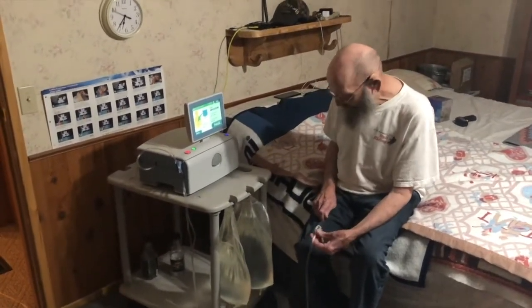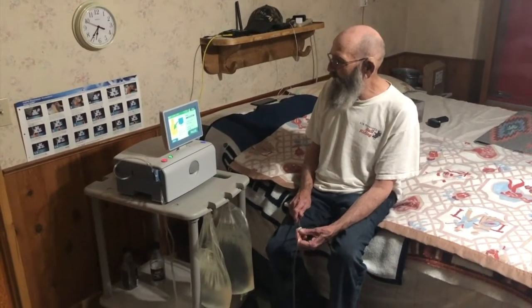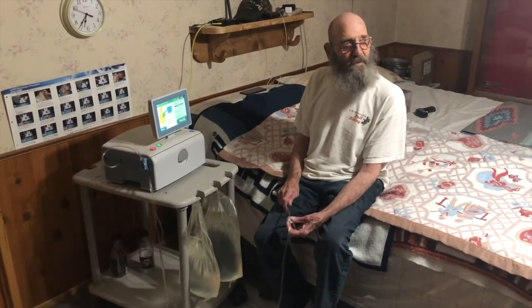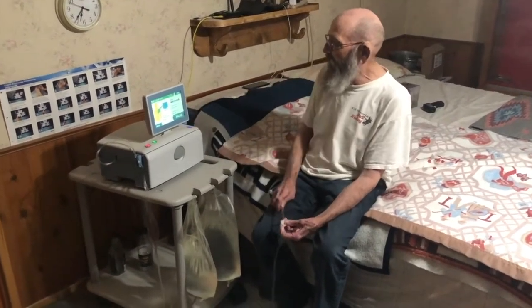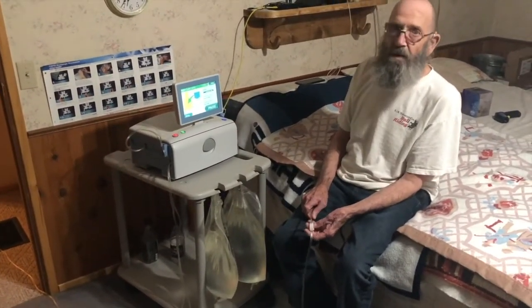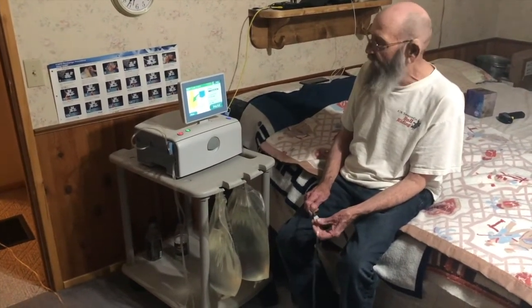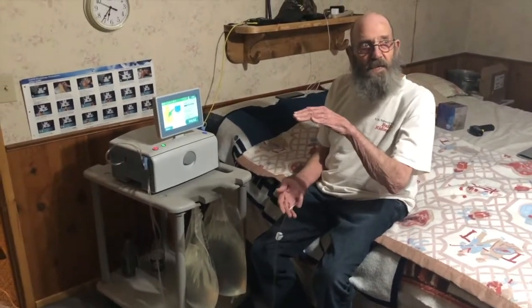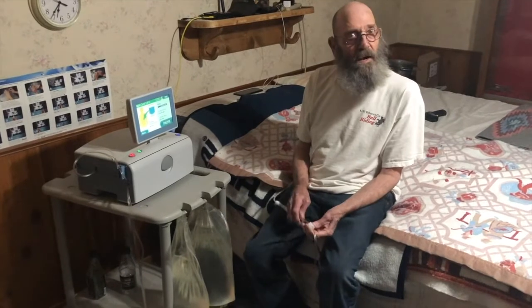So all right, now it's just sweet dreams. Yeah, I'm ready to hit the hay and get some sleep before this thing gets ready to pump off, because I've got to wake up for my pump off. And see, now there's 9 minutes left in this filling cycle. It'll take 9 more minutes to put that amount of fluid into me through this machine. And that's about, if you go to the liquor store and buy those big fifths of whiskey, about 3 of those is how much fluid that puts into me every cycle.